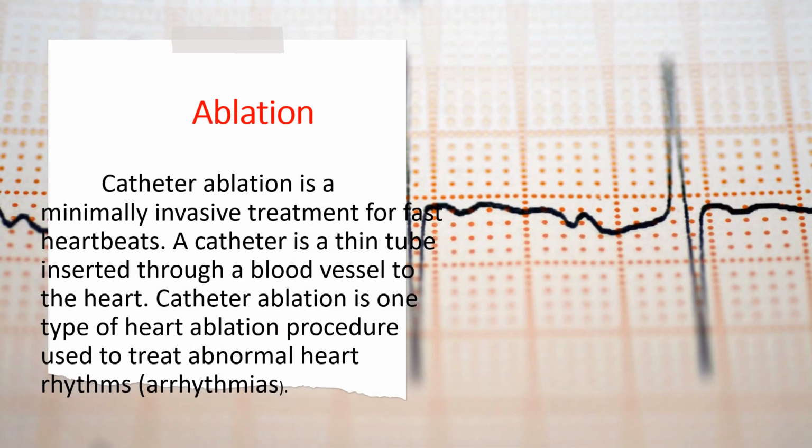Ablation, catheter ablation, is a minimally invasive treatment for heartbeats. If the patient has any premature heartbeats or premature arrhythmia, to ablate that, otherwise called electrophysiology therapy, we will insert a catheter and ablate the premature beats, that is, the arrhythmia.